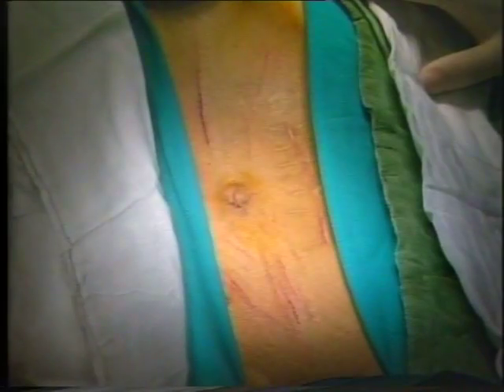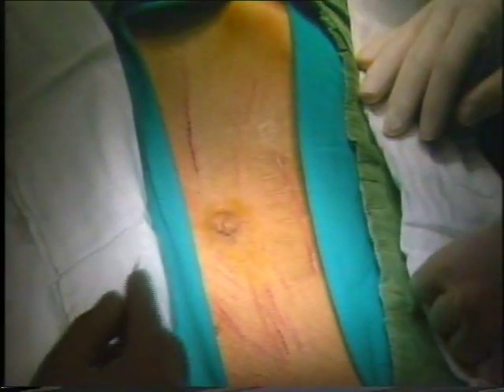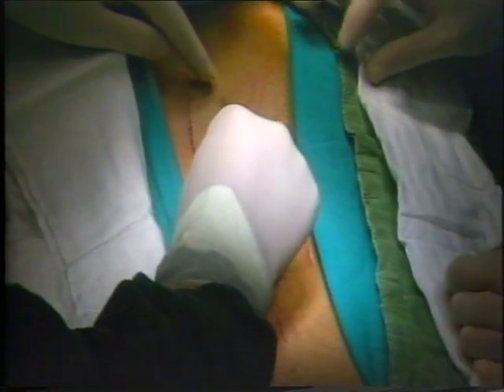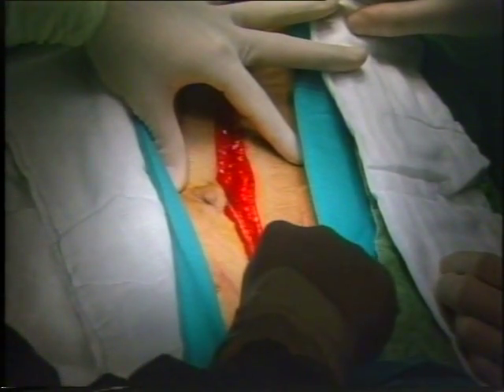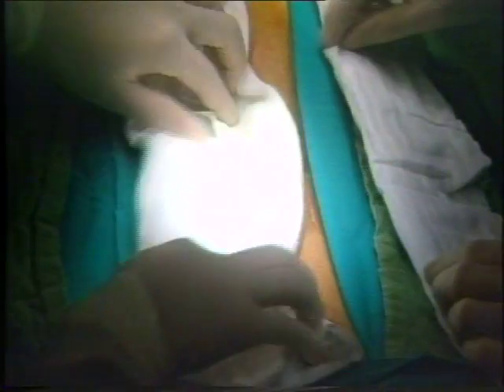Left PCN and antegrade pyelography demonstrate a stricture of the left lumbar ureter. No dye could be traced down to the urinary bladder. Replacement of this ureter by an isolated segment of ileum was planned. For this operative procedure, a long paramedian transperitoneal exposure is necessary.